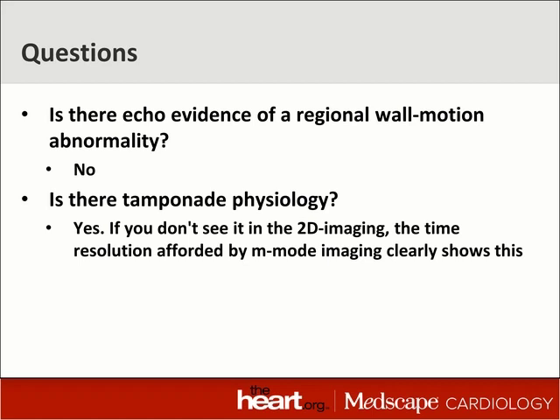So, here are some questions. Is there a regional abnormality? It doesn't seem to be. The wall thickening in all of the views — the parasternal long axis, the apical four, and the apical two-chamber views — all looked okay. Certainly no echo evidence of any previous infarction. Is there tamponade physiology? Well, we covered that. You can see it in the imaging very clearly. You can also look at the M-mode images, which gives additional time resolution, demonstrating that the RVOT starts to expand considerably after the aortic valve is closed and after the mitral valve has opened.